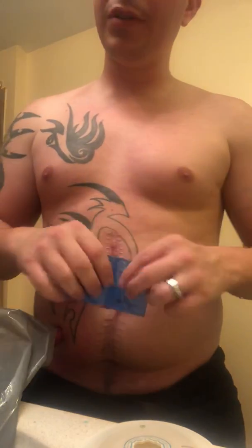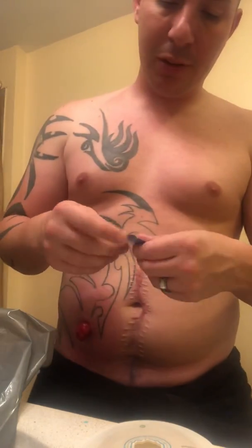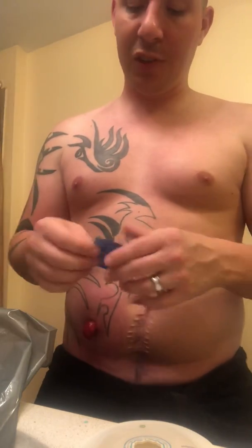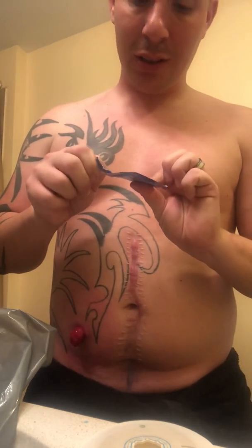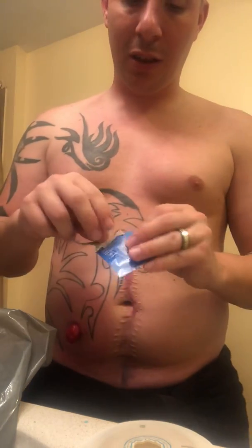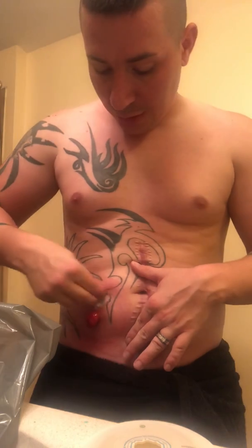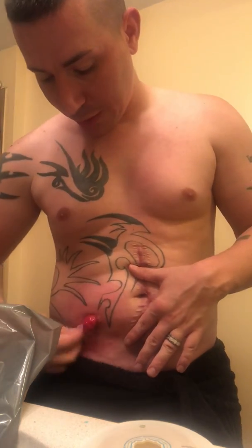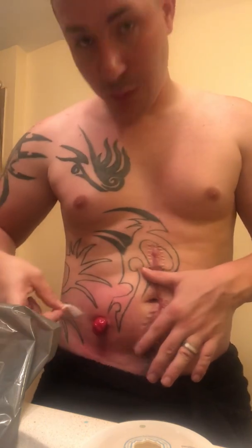Now you're going to want to use your skin protective wipes. It's kind of redundant to use the spray and the wipes, but they each serve a different purpose. The spray just kind of gives you that coating, where the wipe actually has a little bit of alcohol in it and it stings, and it's extremely sticky, so it helps everything adhere. So now go around our stoma before we do anything else. That's why we have two of them.